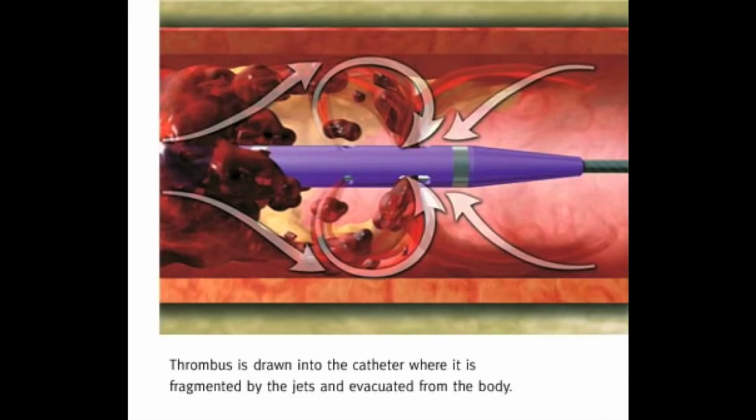It's a fairly extensive setup. It comes with catheters that are 4 French, 5 French, or 6 French. The 4 French and 5 French catheters can work through a 14 thousandths wire. However, the 6 French catheter requires a 0.035 inch wire for selection. So it's very important to know these features before you can decide what catheter is going to be compatible for the passage of these devices.